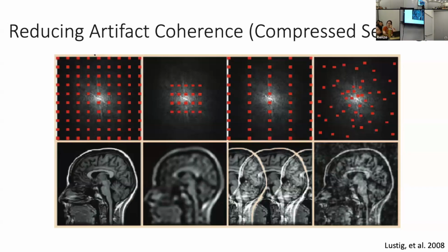And you can kind of see an example of that here, which is essentially just that rather than having a Cartesian grid, you're basically just choosing points as randomly as you possibly can, because then your foldover artifacts are still there. They're identical. As long as the number of points here and here are the same, the magnitude of foldover artifact is essentially the same, with some exceptions. But what you can also see here is that you can much better see which brain is the real brain here. And the reason is that all of your foldover artifacts are not forming a brain properly. So the only one that you're left with was the one that was in the original signal. Does that make sense? Okay.